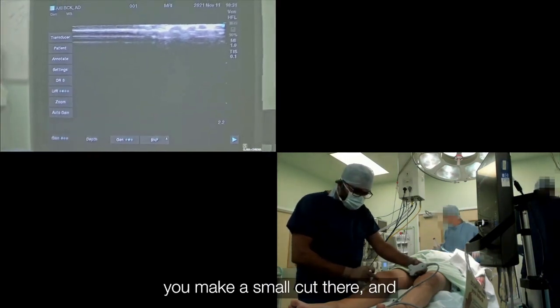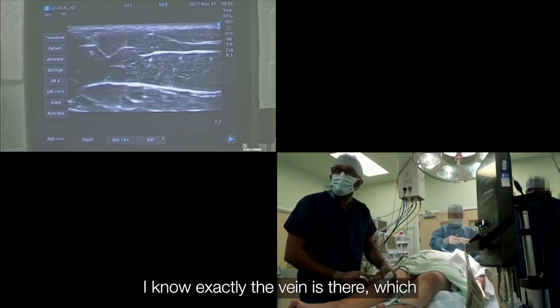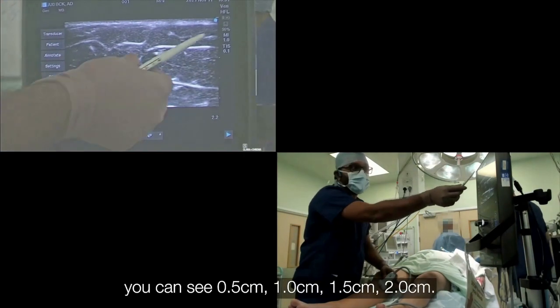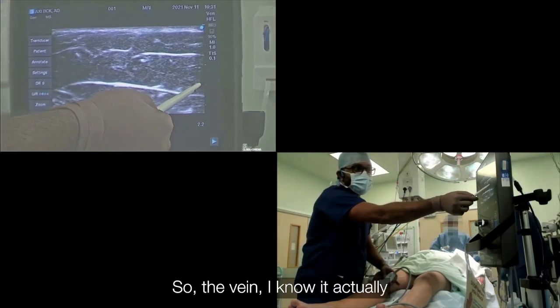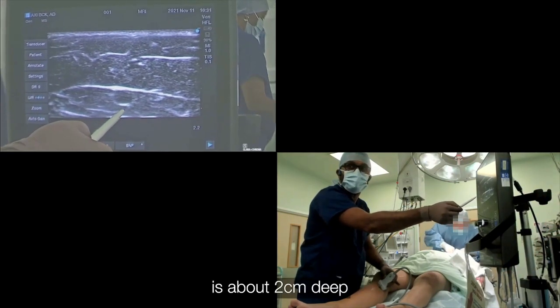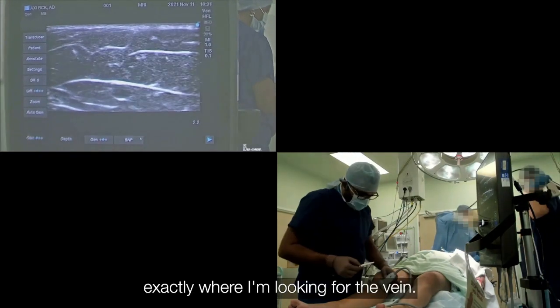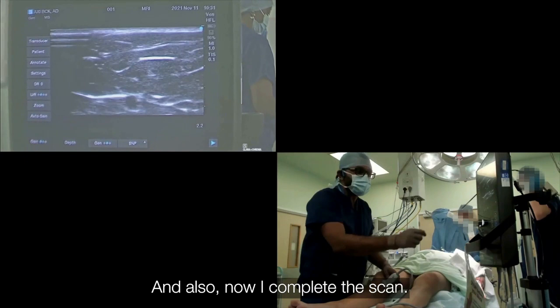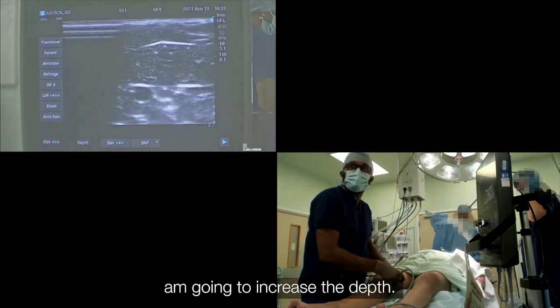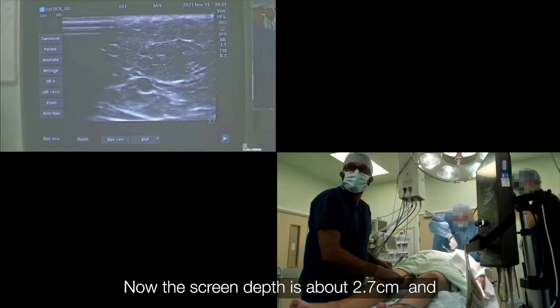The last thing you want is to make a small cut there and not be able to find the vein. I know exactly the vein is there. If you look at the screen, you can see 0.5 cm, 1 cm, 1.5, 2 — so I know the vein is about 2 cm deep from the skin. I know exactly where I am looking for the vein. Now I complete the scan. It is going deep again — it's a slightly bigger leg — so I am going to increase the depth. The screen depth is now about 2.7 cm.